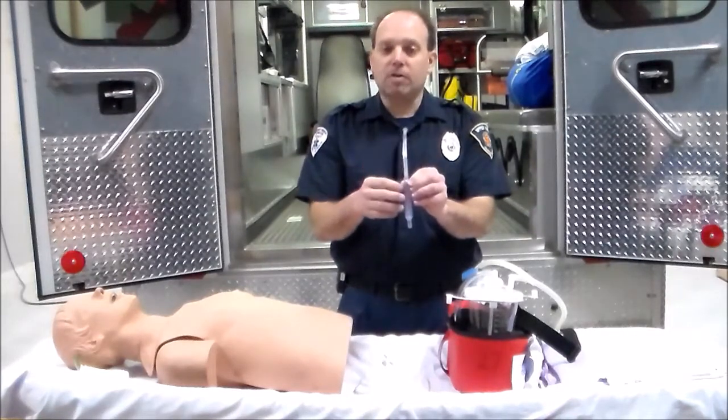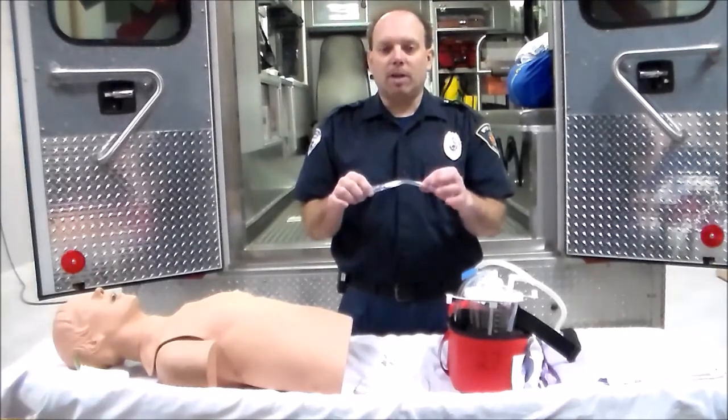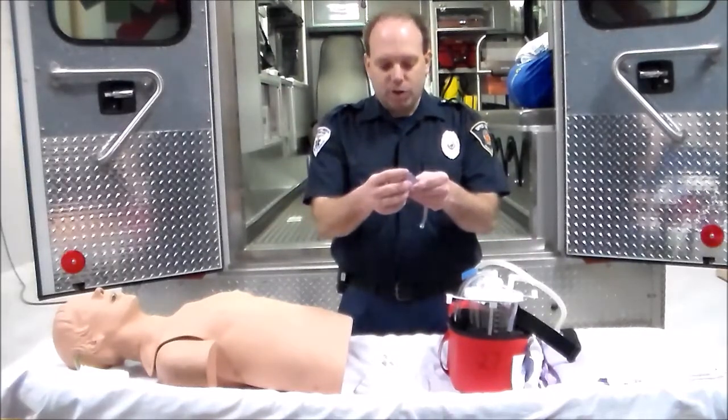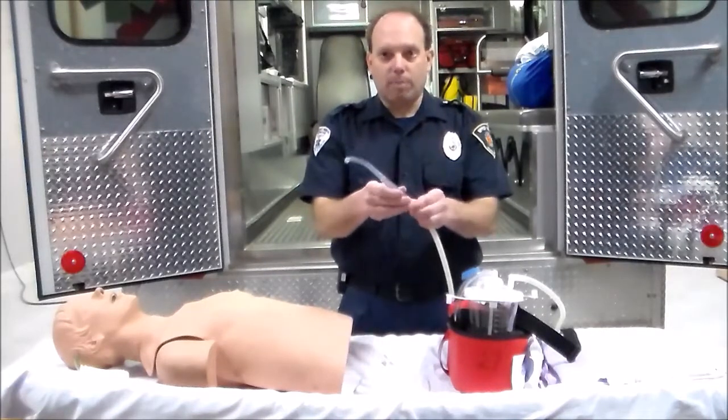It becomes very important because whenever we insert this into the patient's mouth, we want to make sure that we're not suctioning as we're going in. We always suction on the way out. This then connects to the non-kink tubing and we are set.